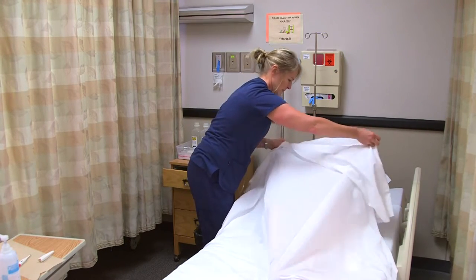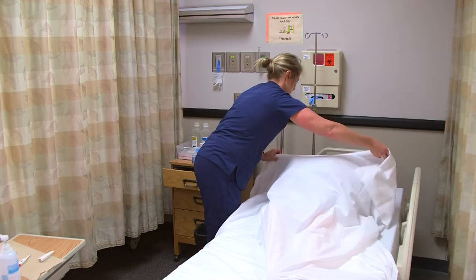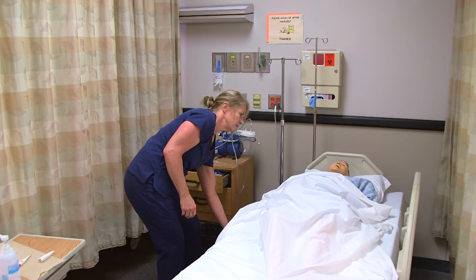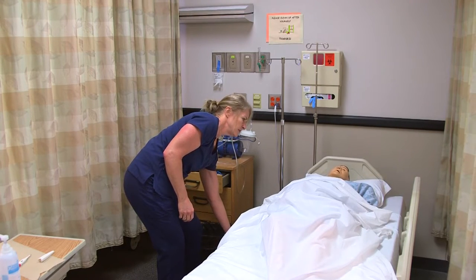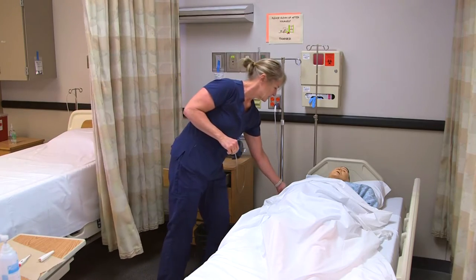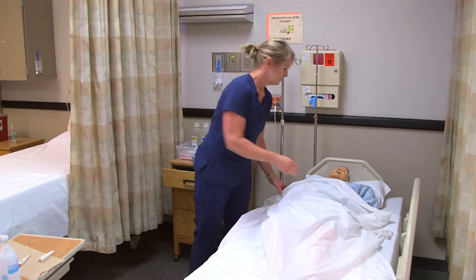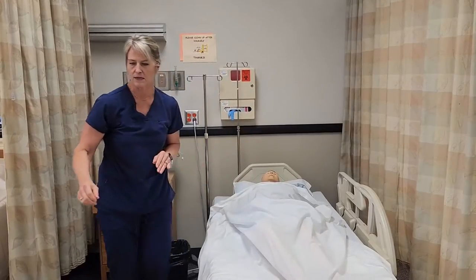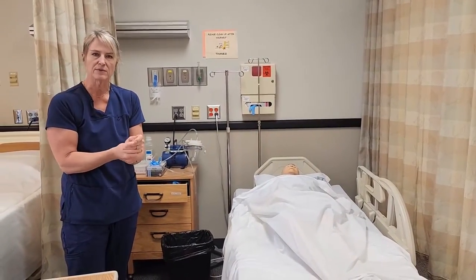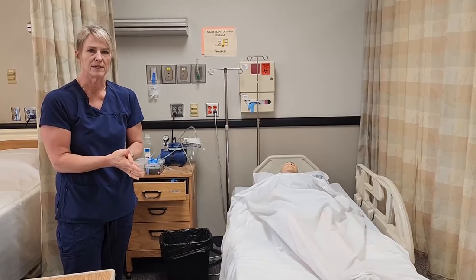Get you covered up. Are you comfortable? Then I would lower the bed and open the curtain. Make sure you have your call light and the bed is locked. Then I will sanitize my hands again, bring the thermometer back to wherever it's stored, and document the temperature.